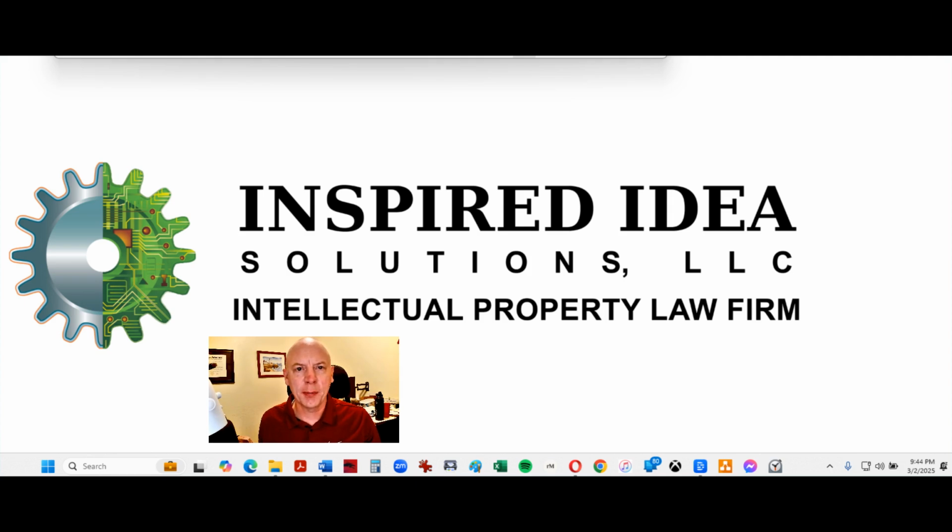I'm a patent attorney and spend a lot of time in meetings over the internet on Zoom, Google Meet, and WebEx. I also make phone calls through my computer with this method.